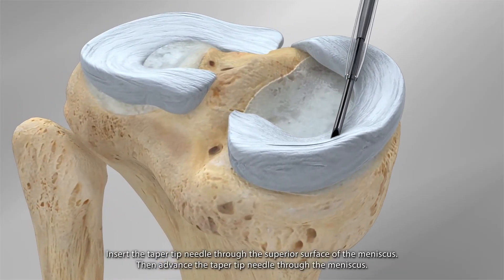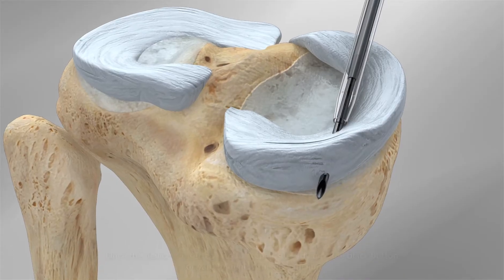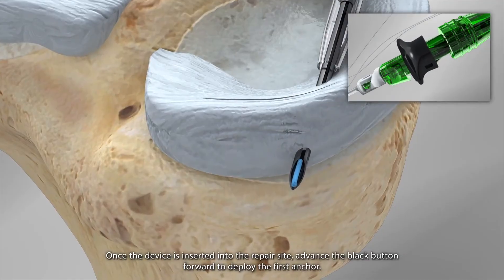Insert the taper tip needle through the superior surface of the meniscus. Then, advance the taper tip needle through the meniscus. Once the device is inserted into the repair site, advance the black button forward to deploy the first anchor.